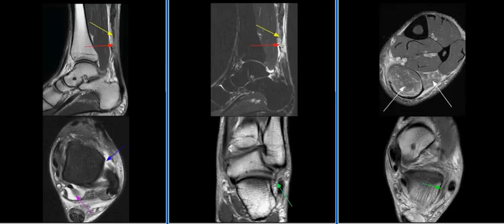The MR findings are consistent with: number 1, complete Type 2 Achilles tendon tear; number 2, anterior talofibular ligament tear; number 3, scarring of the calcaneofibular ligament; and number 4, tenosynovitis of the flexor hallucis longus tendon.